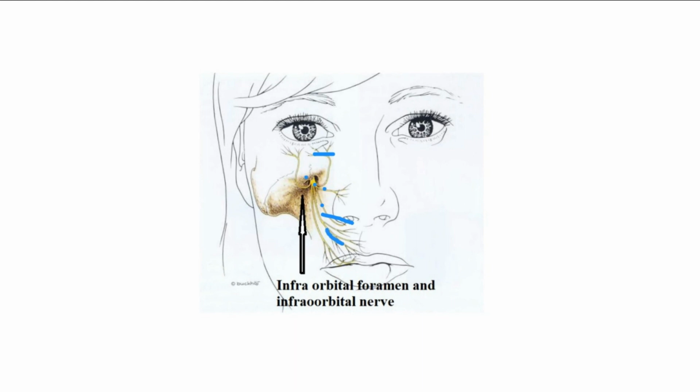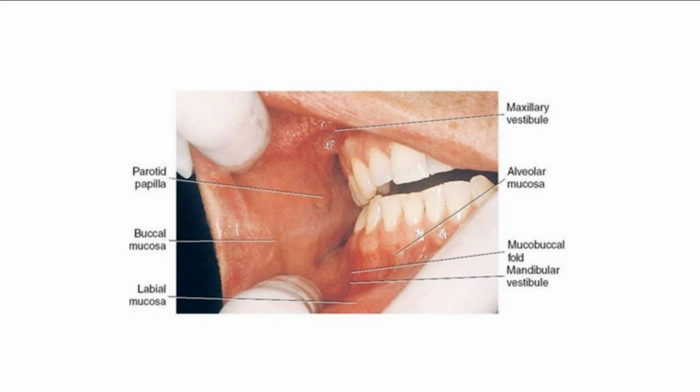I just mentioned it. The anesthesia is a solution. It's a liquid. It will get inside and go inside the canal, the infraorbital canal. So you will get the infraorbital nerve, and where the ASA and MSA come out, they will be blocked. It's used as an alternative to ASA, and you will see the actual techniques.